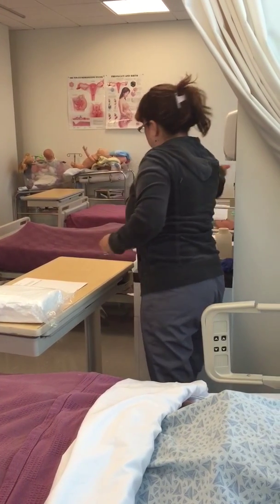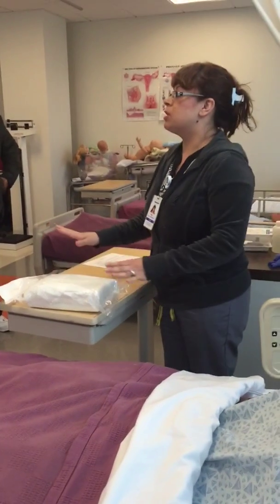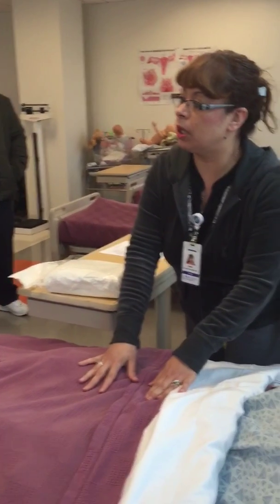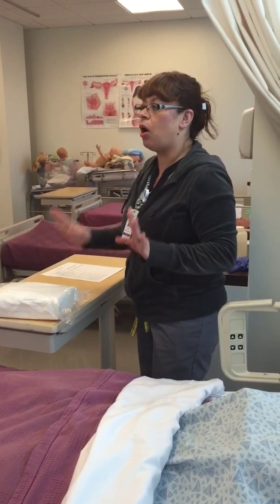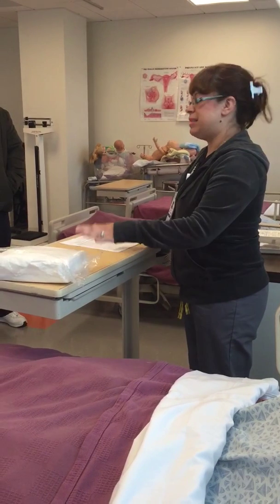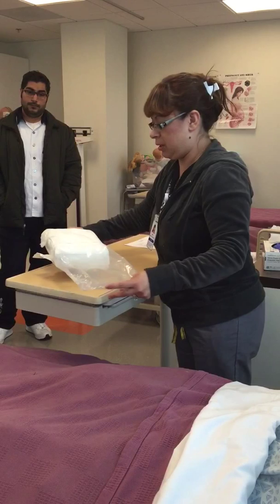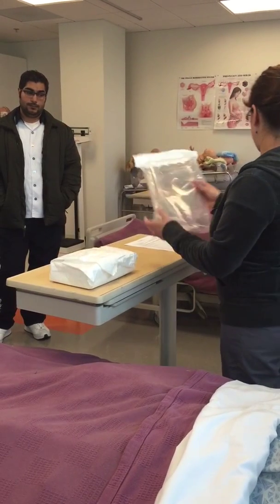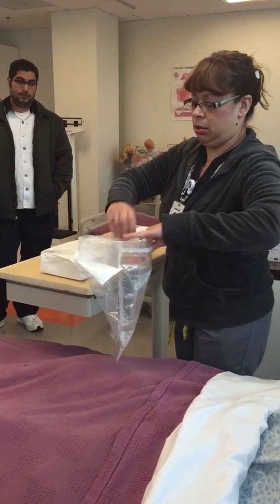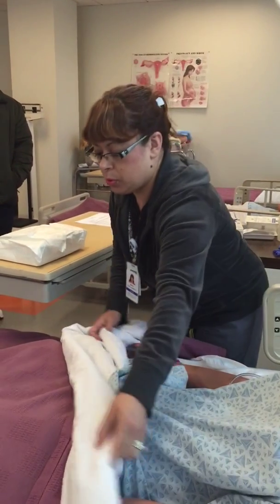Wash hands again. Now I'm going to start opening my kit. There's two ways you can do this. Either you can leave it on the table and then bring it here, or you can bring it here in the middle of the legs. I'm not picky. However you're used to doing it, I'm okay with that. For the case of demonstration, I'll leave it on the table for now. So I'm going to pull the package away, and I'm hoping that this has everything I need. And I'm going to use this as a trash bag. So I'm going to put that here, and I'm going to expose.